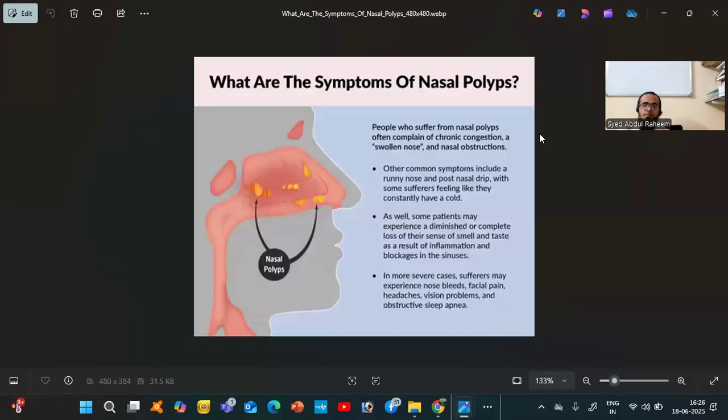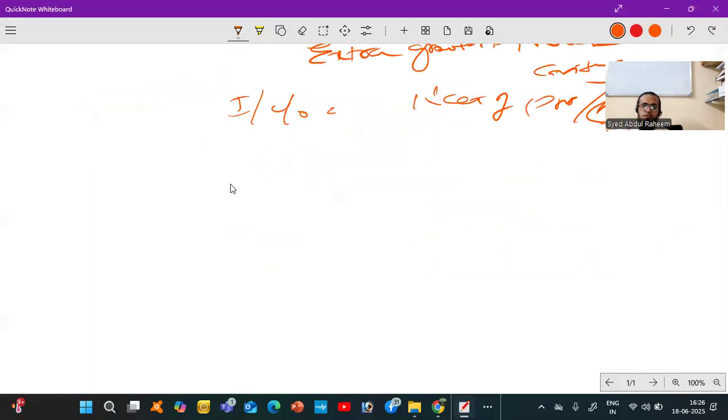Okay. After that we have the third common pathological condition, that is facial trauma.